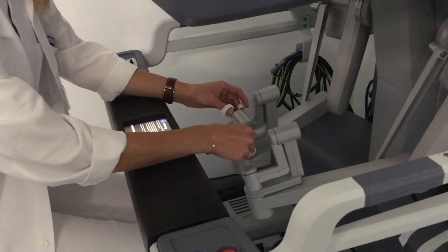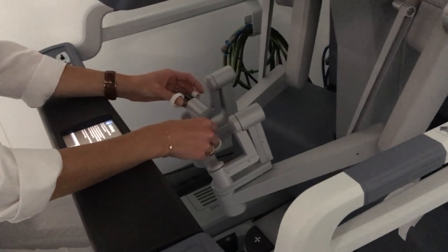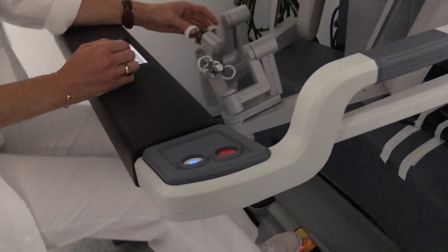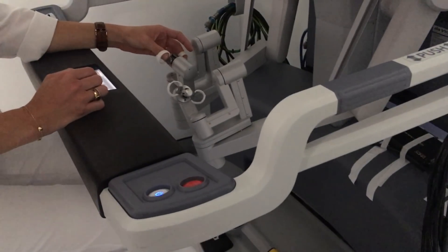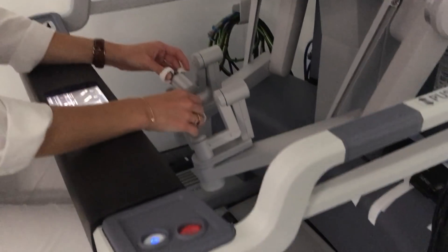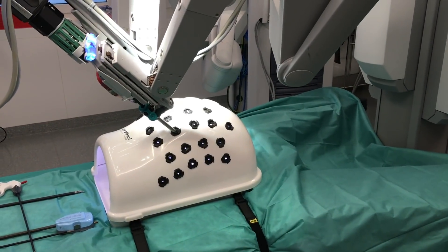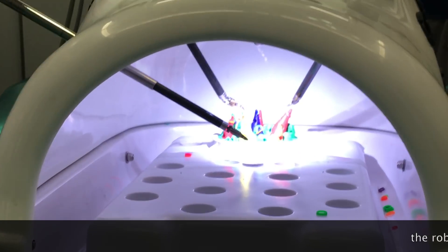Here you can see how to use this thing: you hold the grip with your thumb and middle finger, the index finger is free for a third button, and then you just move it around as you would move instruments with your own hands.